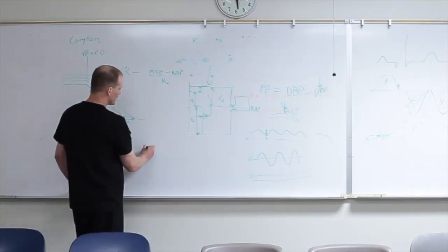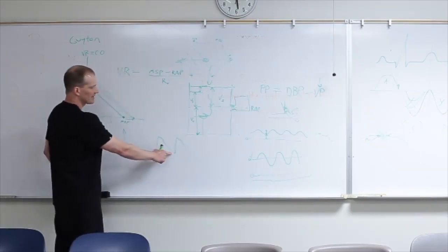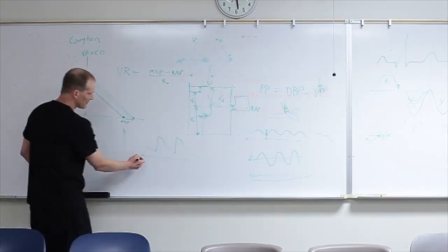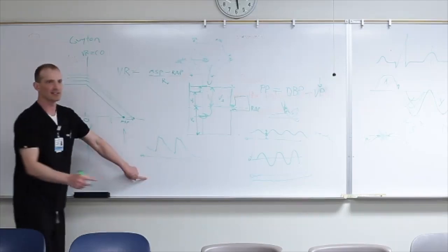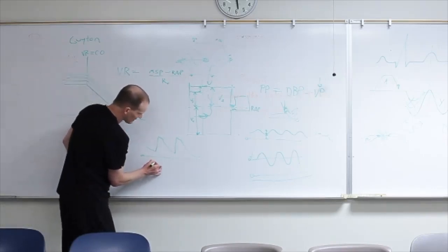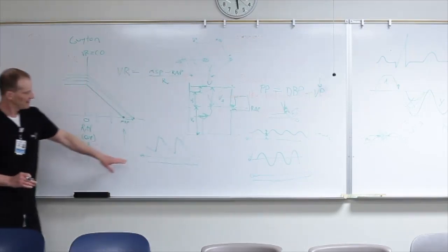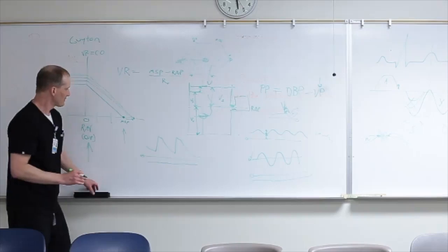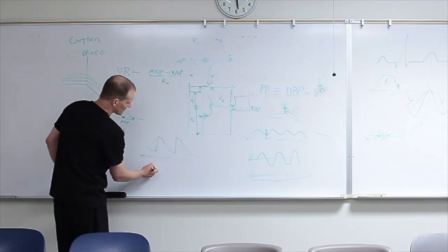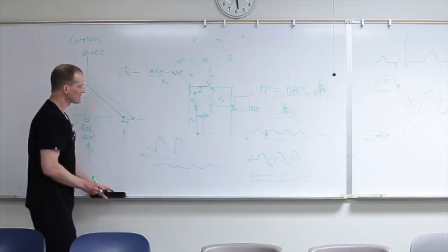Don't pay attention to this, but there is going to be a systolic and diastolic arterial component when we Doppler the kidneys. But you're Dopplering the arteries and the veins in the kidney at the same time with the same pulse wave gate, and so we will see this kind of hum, just like we would with a normal portal vein, happening on the venous side. And then as the pressures get higher, it starts to get pulsatile.